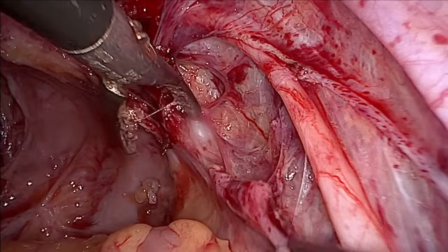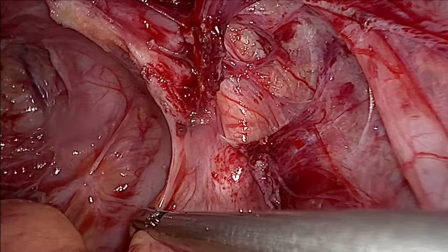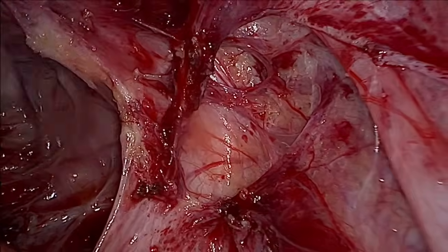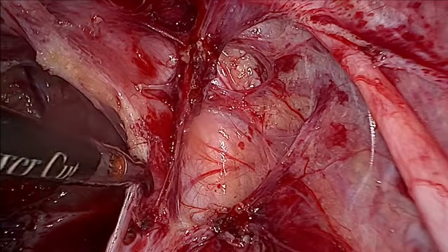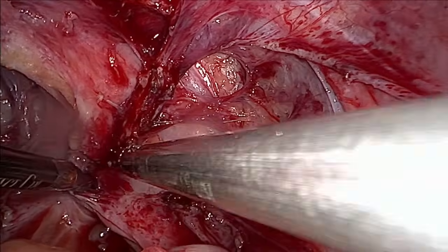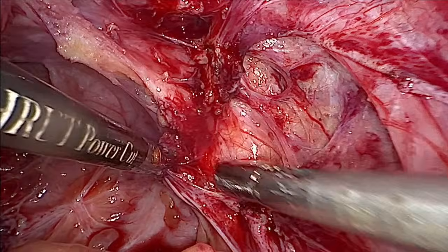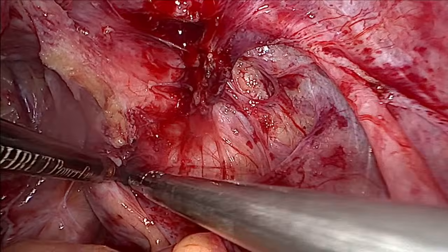Okay, now I can just go like this here. Okay, and create a plane here. This is the pararectal space, this one.